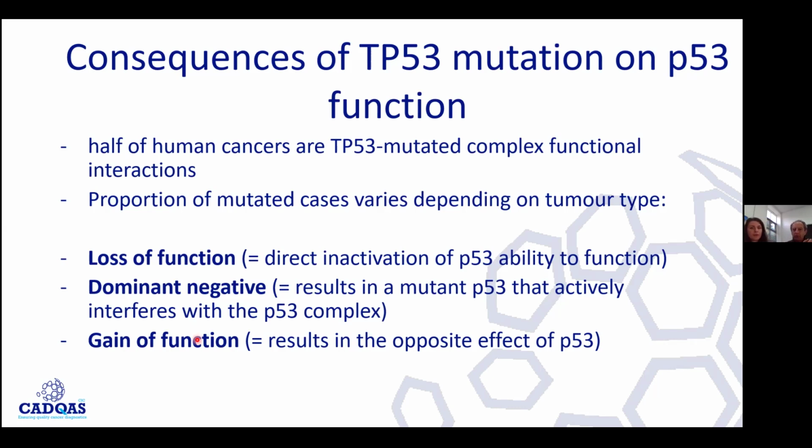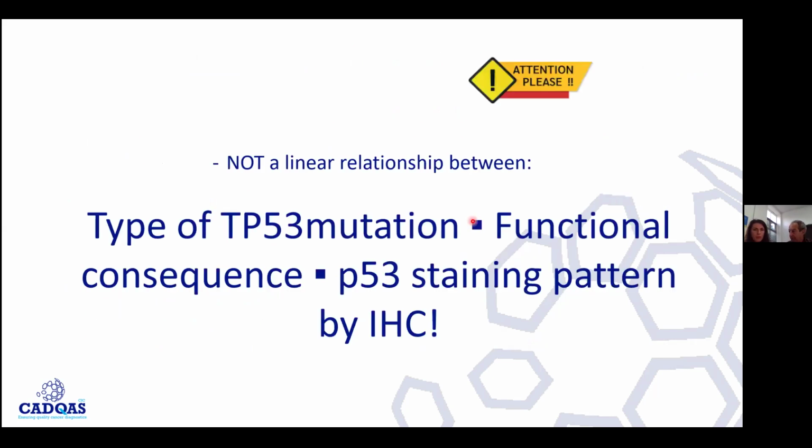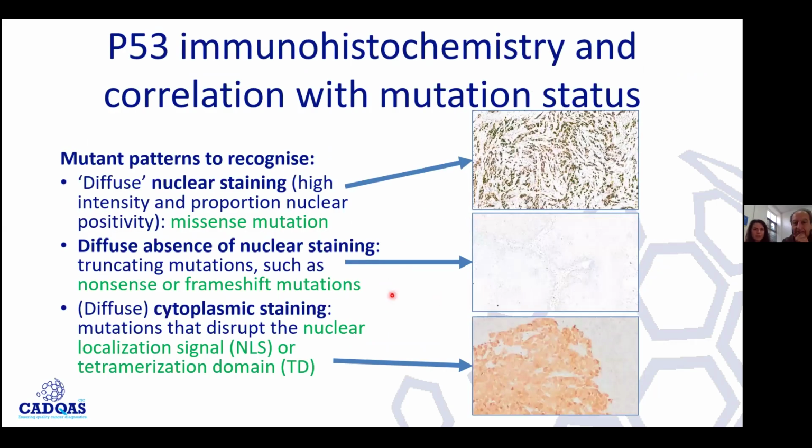So I look forward now to some of the examples you will hopefully give us, in the context of particular pathological conditions, I guess, and how we interpret these. Yeah. So fantastic. These are just to illustrate what we've already talked about. The missense mutation is associated with a missense mutant pattern, which is diffuse positivity, but I will go through each one of them. And again, we see the strong staining intensity. This shouldn't be. Once we see strong staining intensity, I think we already need to be alert, regardless of the overall pattern. And I'm going to show you some special mutated patterns that demonstrate this, actually.